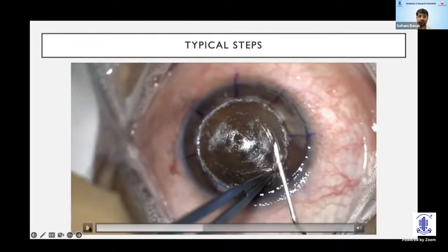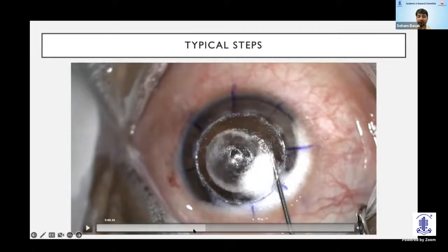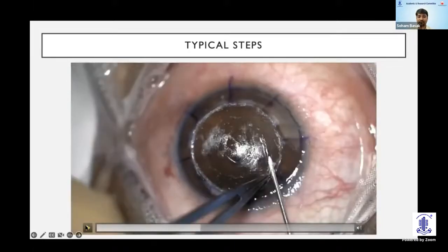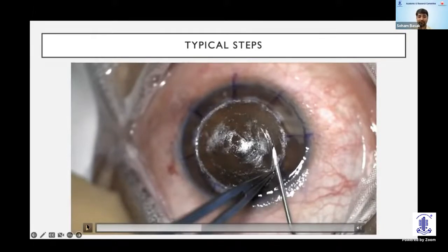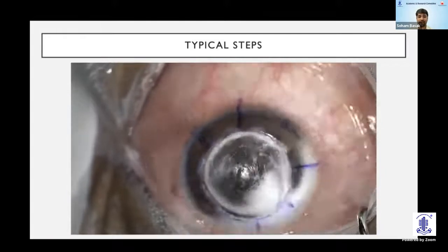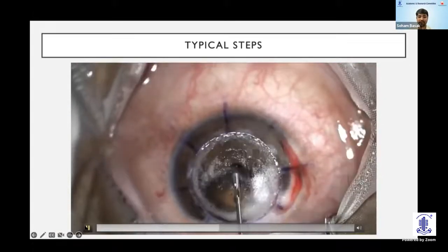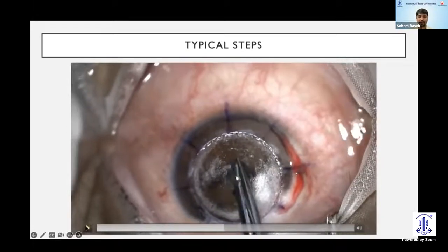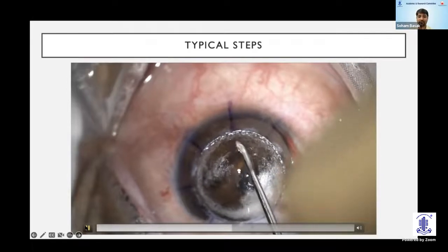Slowly go in intrastromally. I prefer injecting the bubble from the paracentral area, so that even if a perforation happens, it is maybe away from the central axis. And inject, and there you have a big bubble. Then you do a paracentesis, decompress the anterior chamber, followed by opening up of the big bubble, and then de-roofing it.